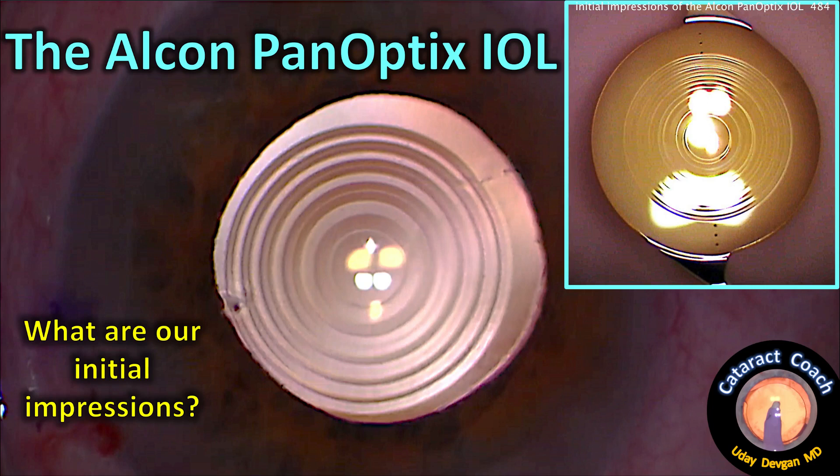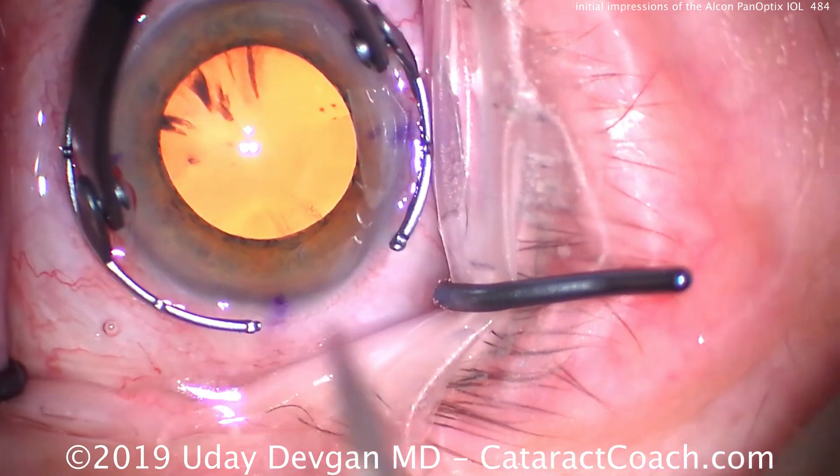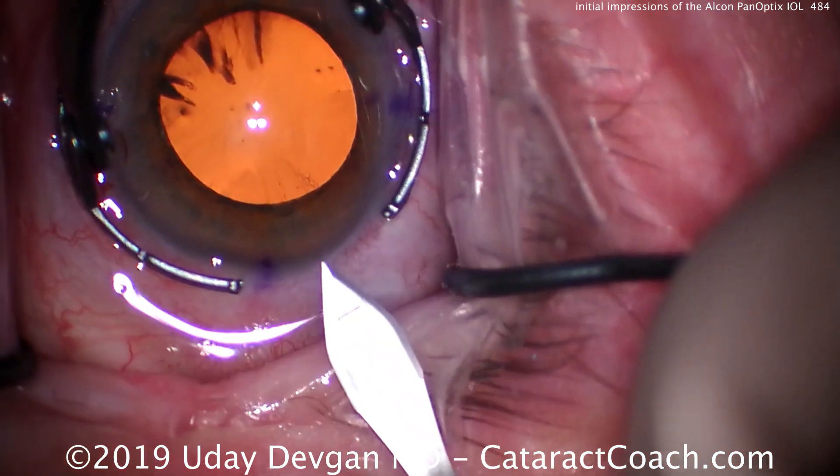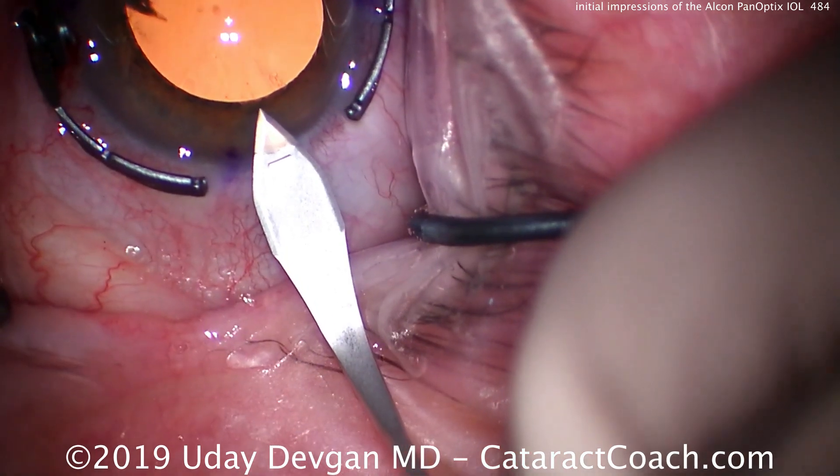From cataractcoach.com: what are our initial impressions with the Alcon Panoptix IOL? This is the first trifocal IOL for the US market. It's also a toric lens, so you can see we're making our main phaco incision 90 degrees away from the steep axis.